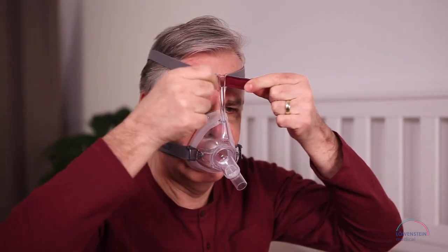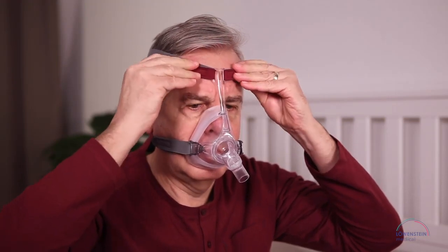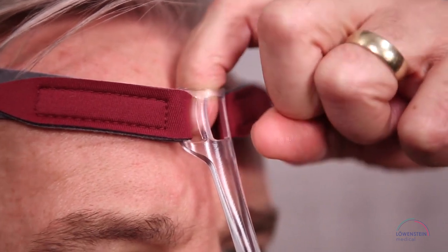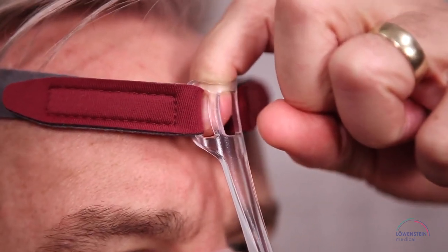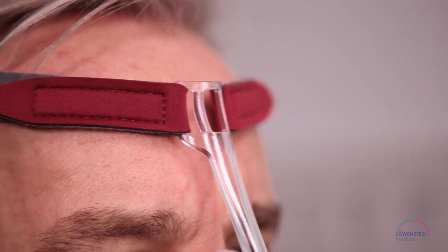Now adjust the upper hook and loop tabs. The same applies here, as loose as possible. Here's a little tip: the forehead support lightly touches your forehead or not at all.